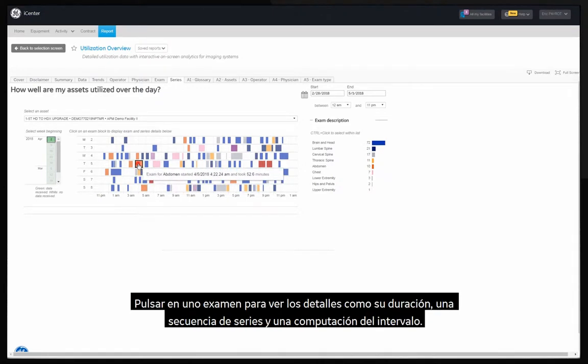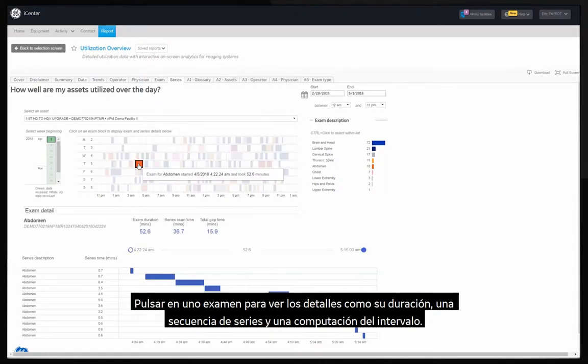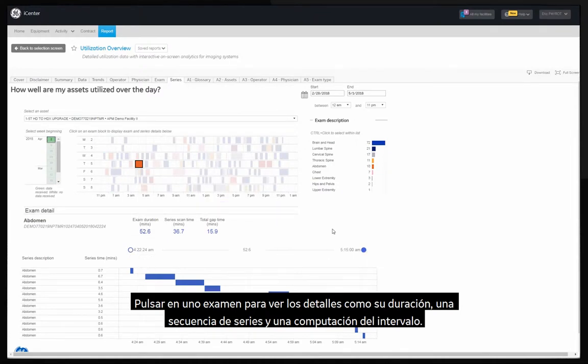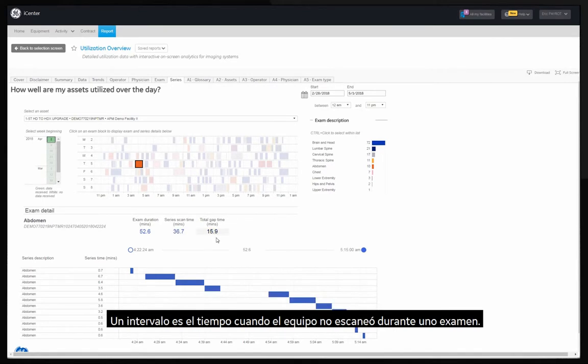Click on an exam to view the exam details like exam duration, series sequence and a computation of gap time. Gap time is the time when the equipment was not scanning during the exam.